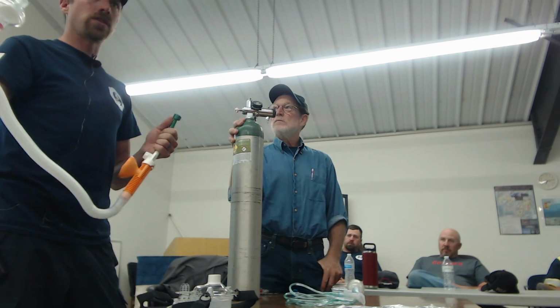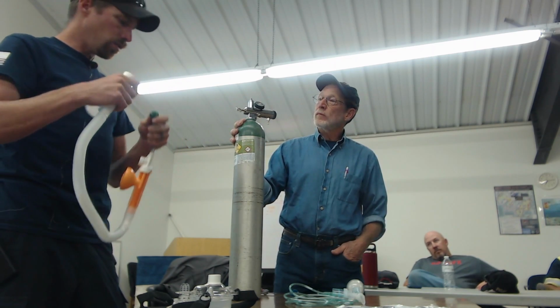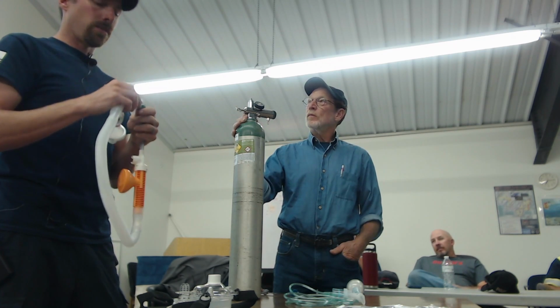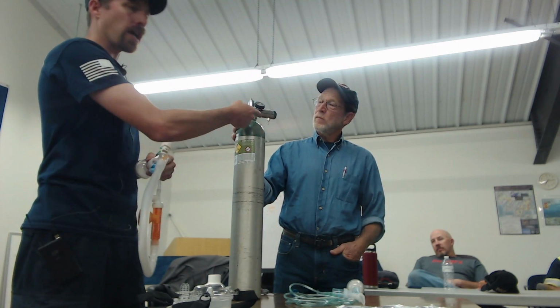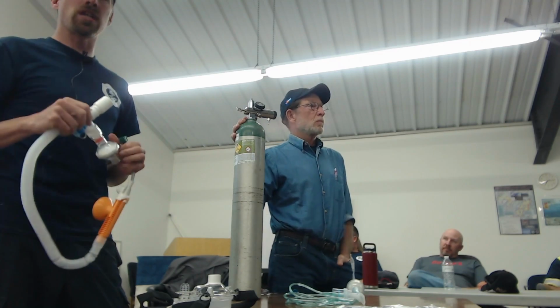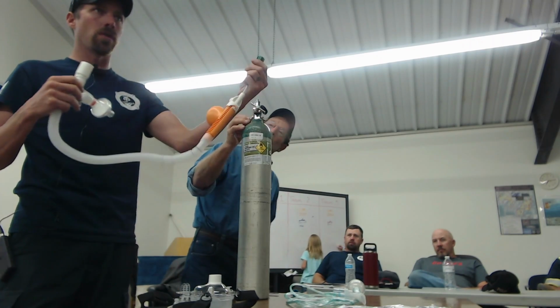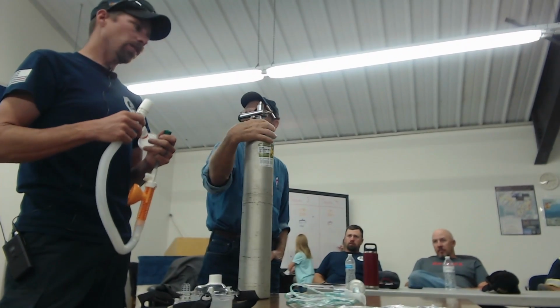If you're on house oxygen in the ambulance, you can hook this straight into, I didn't bring it up here, the OMEDA connection on the wall port. Also, most of our wall ports have both the regulated and a high pressure hanging right off the bottom of them. So most of the time, you don't even have to change anything on the wall of the ambulance. You just screw this on there to the high pressure port, whether it be on your portable device or in the rig. So there's 2 high pressure ports on this regulator, either one. Either one. Yep.